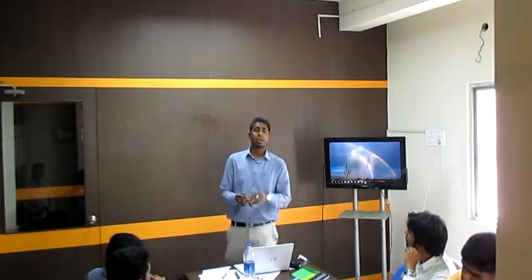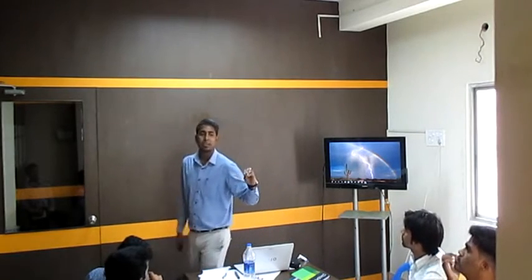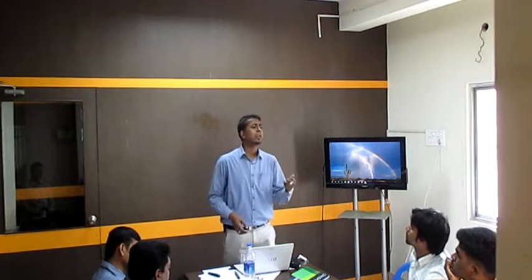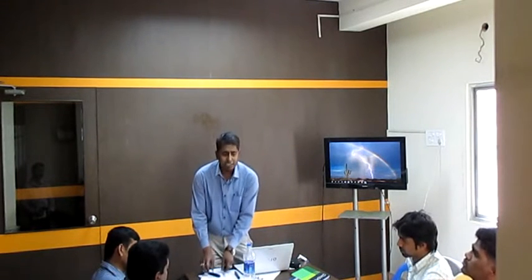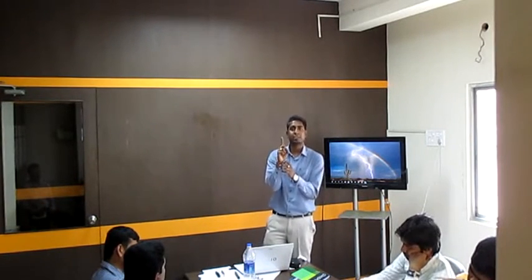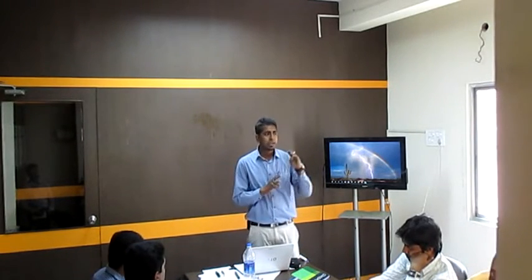Right. Now we are coming to the classification of handpieces. How to classify handpieces? Because the doctor will ask you, I need a contra-angle, or I need a high speed. So what are the classifications of handpieces? The first classification is on the basis of driving mechanism.